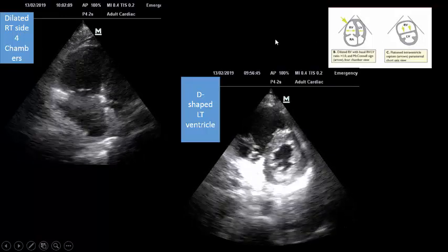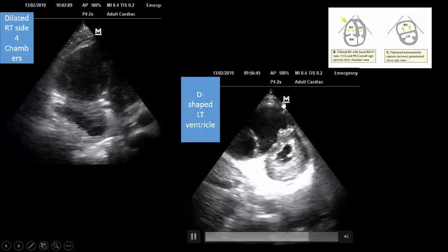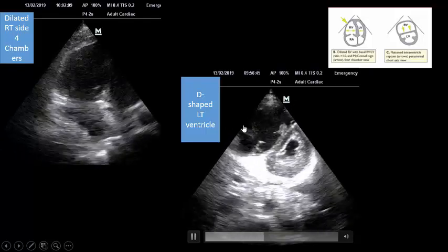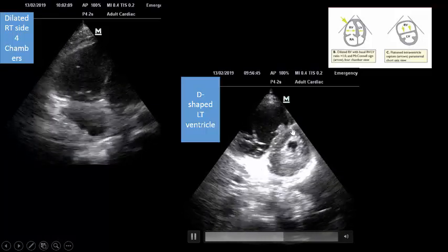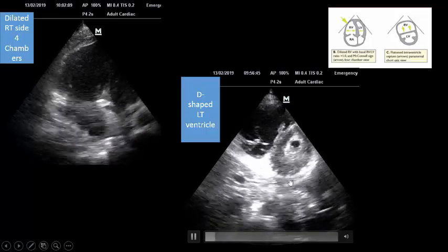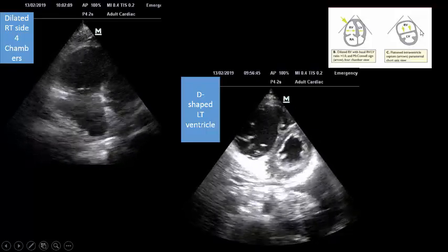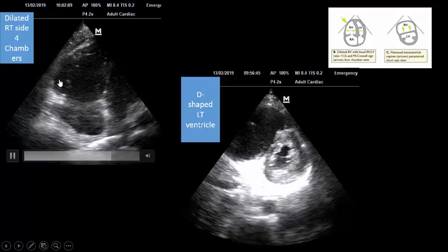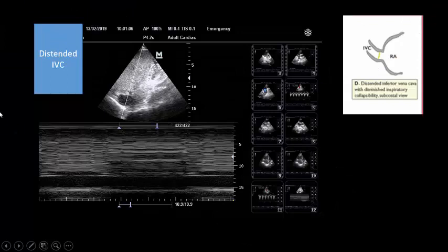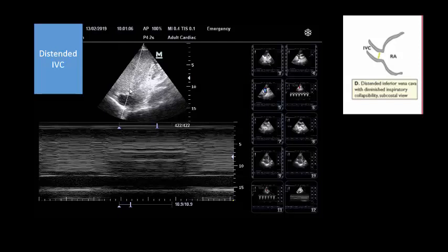Sign number two: in the parasternal short axis view, because the dilated and overloaded right ventricle displaces the septum — which is shared between the two ventricles — toward the left ventricle, you will see a D-shaped left ventricle, especially in systole. This is pressure overload. This increased pressure in the right ventricle also reflects back on the inferior vena cava, so you will see a dilated inferior vena cava. All these images were obtained in one patient at the same date and time — the complete package shown in the ESC graph.